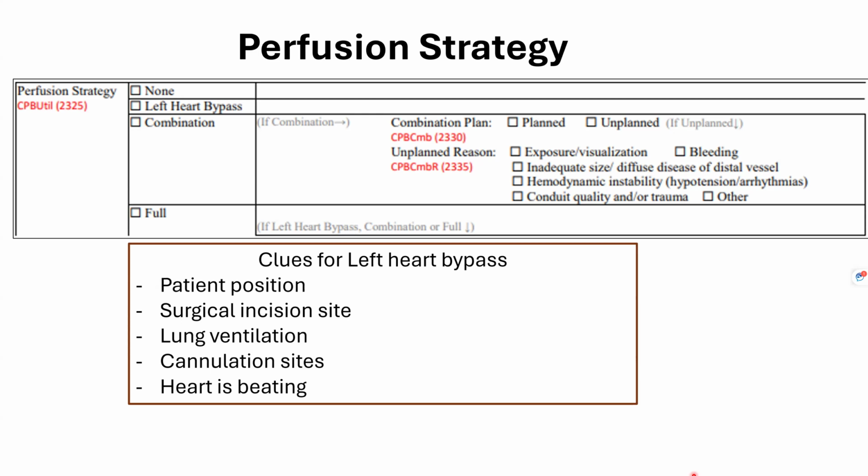I mean, we do this to protect your lower body and everything below, like everything in your gut. Why don't they do it for aortic surgeries? I feel like most of our aortic surgeries are just clamp and sew. Yes, and it all depends upon what section of aorta they are repairing.